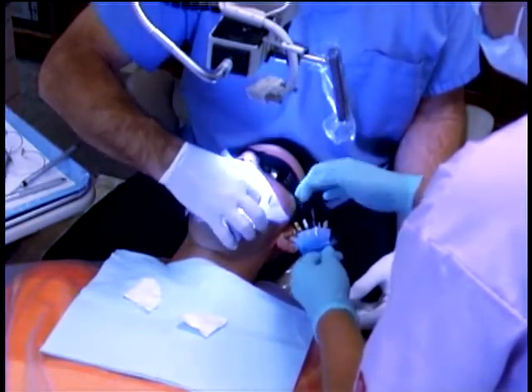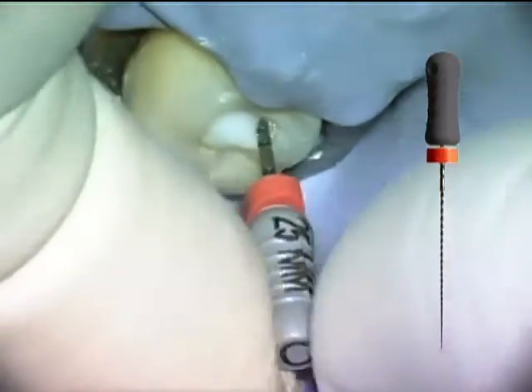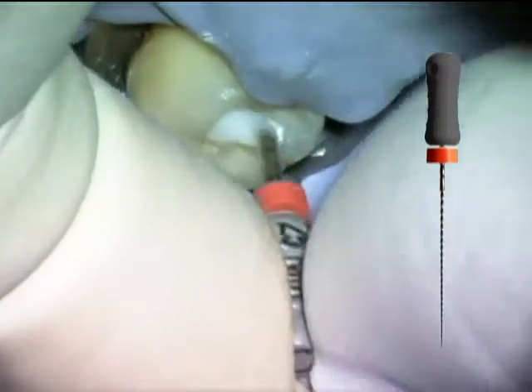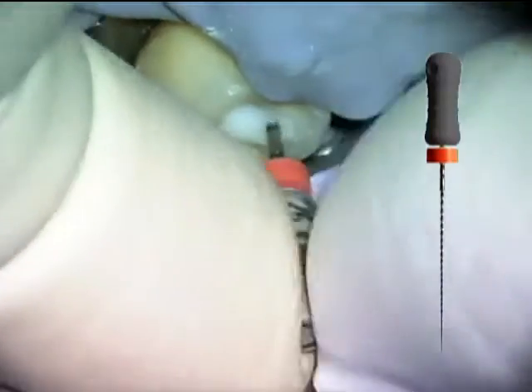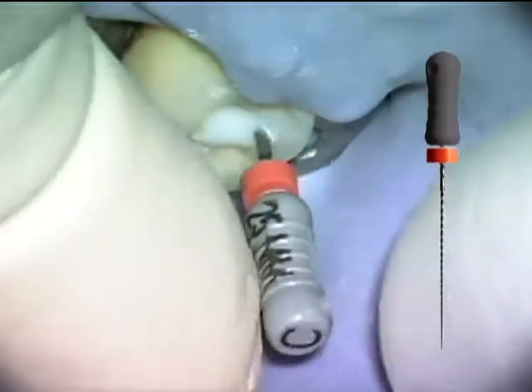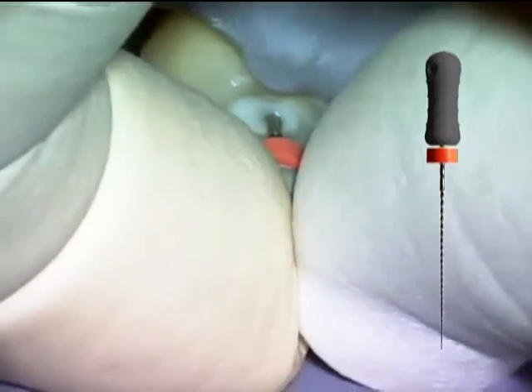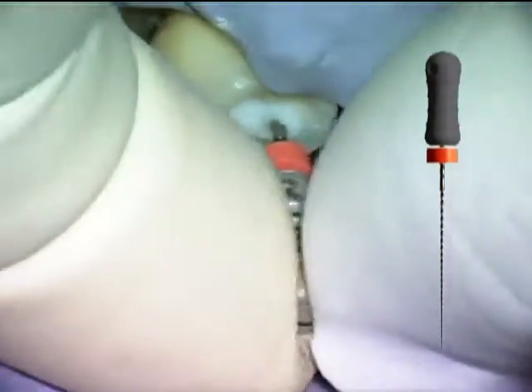The initial instrument placed into the apical third of small canals is the number 08 LexCon file. Initial files larger than this can push pulp tissue into the canal terminus, causing a sometimes irreversible blockage. Negotiating instruments are used with a watch winding motion. Here we see that followed by several pull strokes to loosen it, then it is watch wound again.